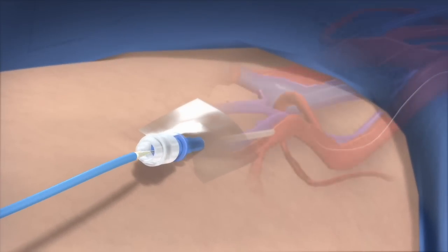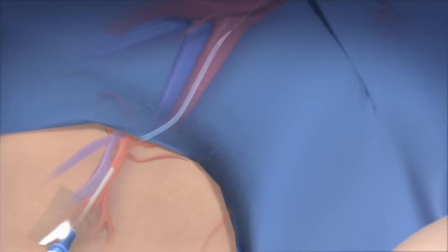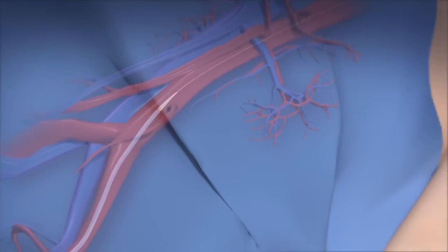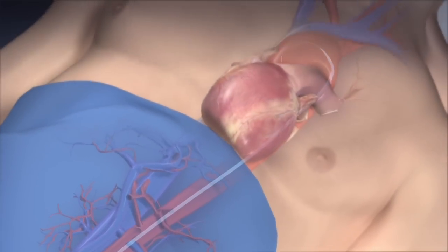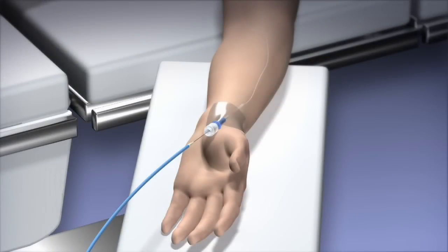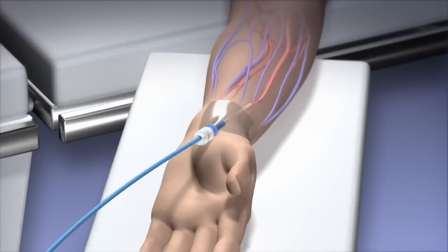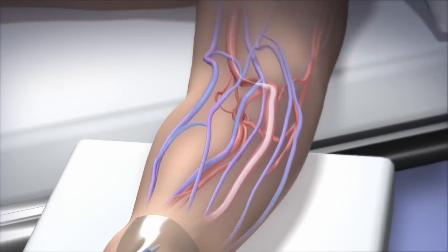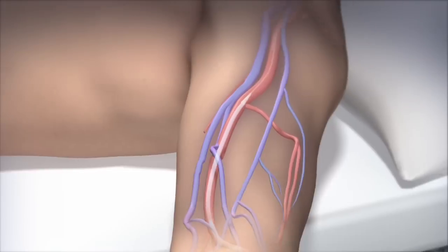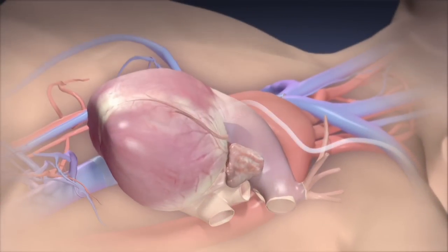Here's how the two procedures compare. For the traditional method, doctors place the catheter into the femoral artery and run it up to the heart. For the other method, doctors start at the radial artery in the wrist and thread the catheter to the heart — the same access to arteries, but fewer risks.